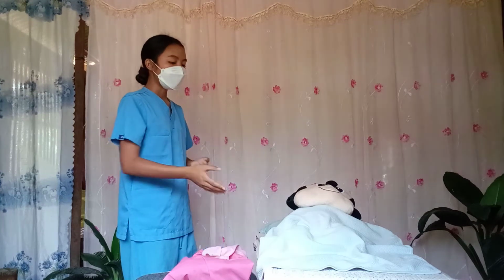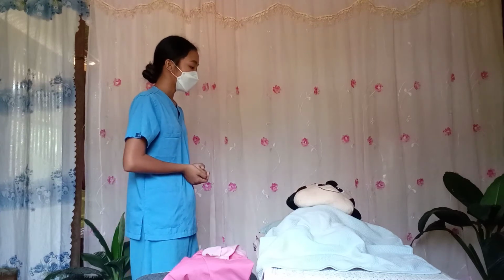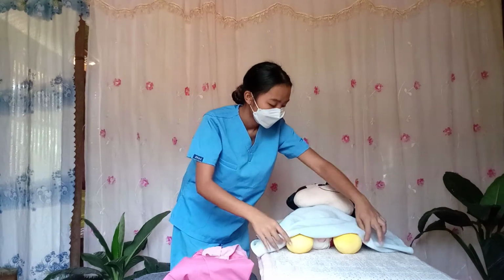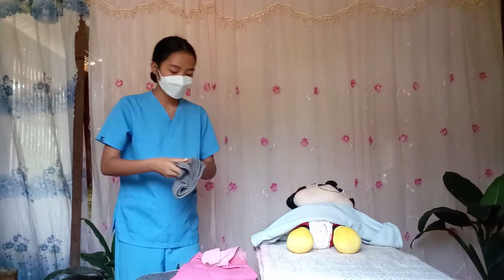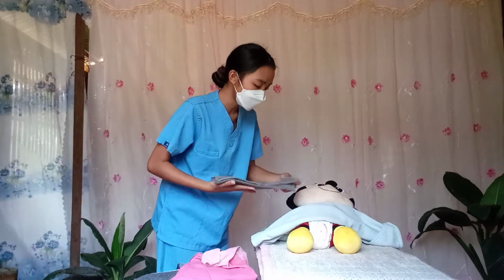Ma'am, I am now going to expose your genital area. Is it okay? Thank you so much. Then put a pad underneath the patient. This is to protect the bed linen from getting soiled. Ma'am, can you lift your buttocks for a second?